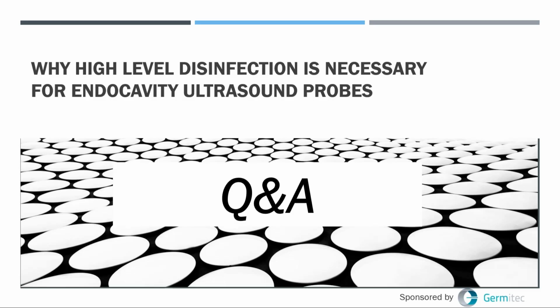If I clean an HLD the probe and achieve over a 6.5 log reduction, why do I need a probe cover? I get a better image clarity without it, and it would save time. Again, if you're using cleaning and appropriate disinfection, you are over 10 to the sixth, and therefore you would meet the guidelines for a high-level disinfection and would not need a probe cover.